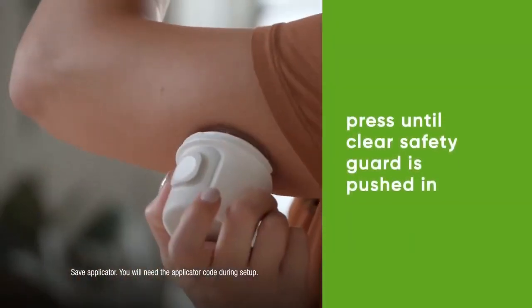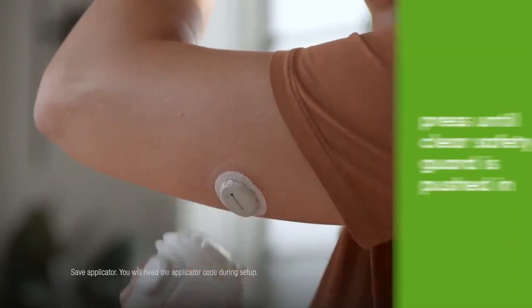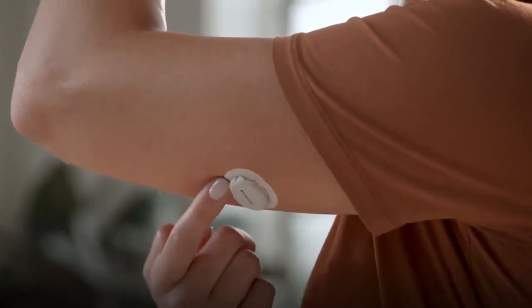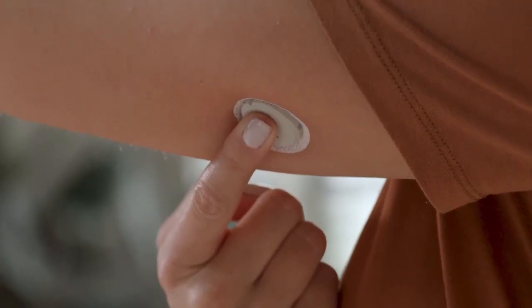Press and hold the applicator firmly against your skin. Now push the button and remove the applicator. To help keep the patch on your skin, rub firmly around the patch three times. Then press gently on the sensor for 10 seconds.